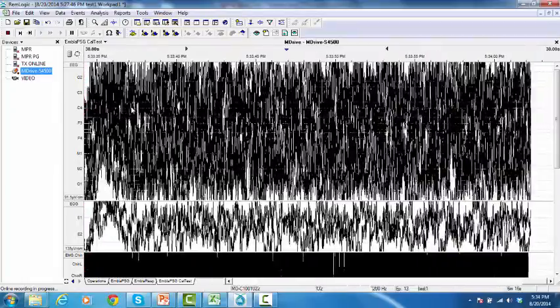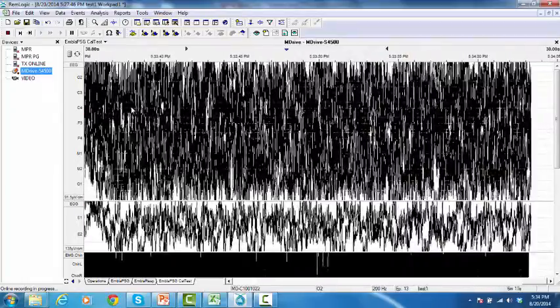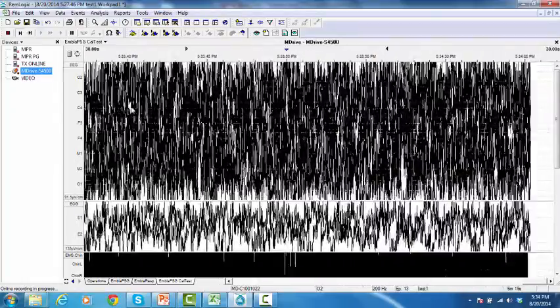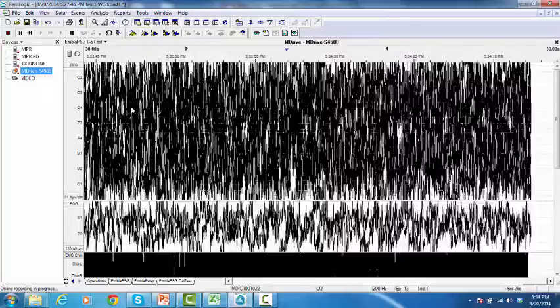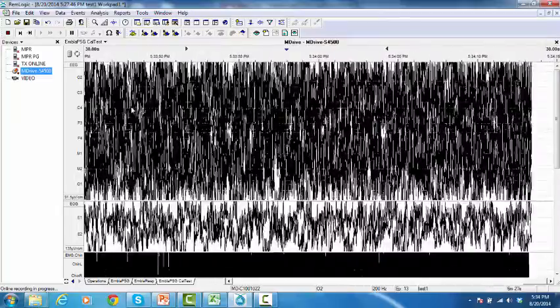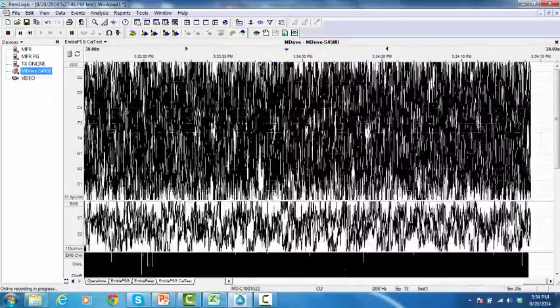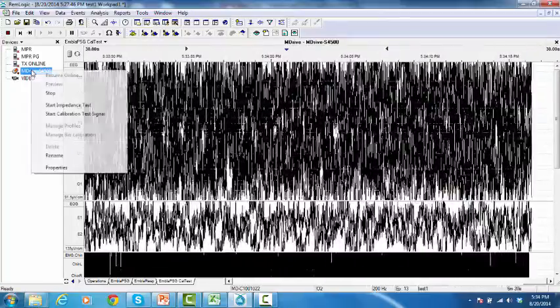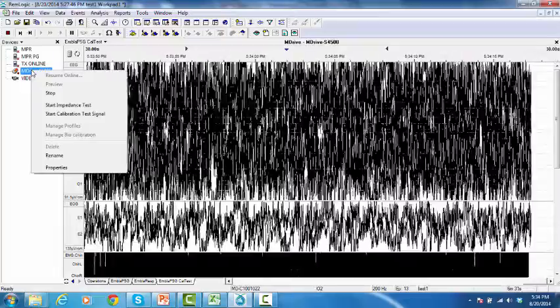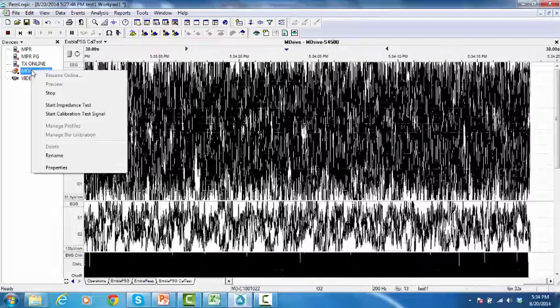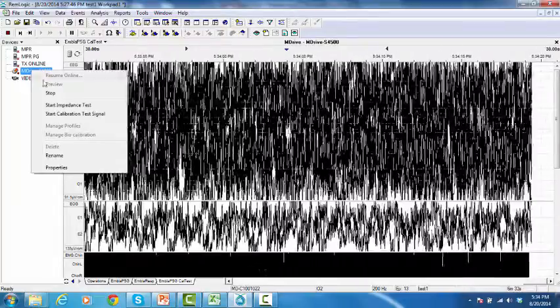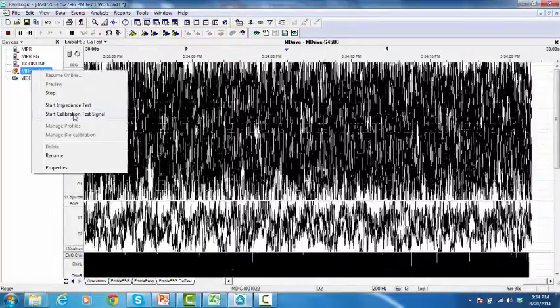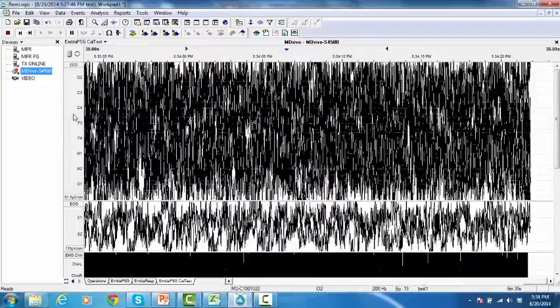To calibrate the test signal, do one of the following. From the device manager, right-click on the M-Drive and select Start Calibration Test Signal.